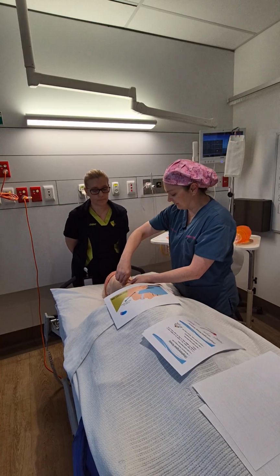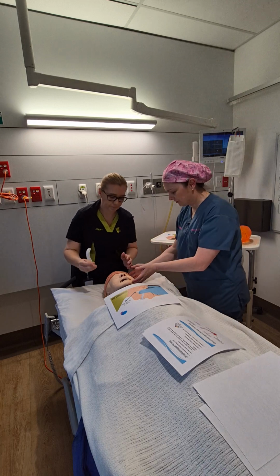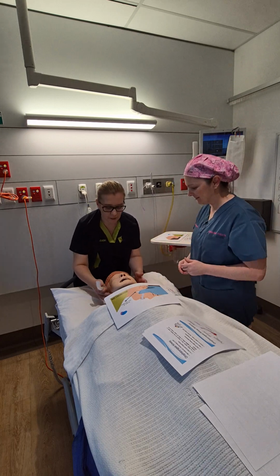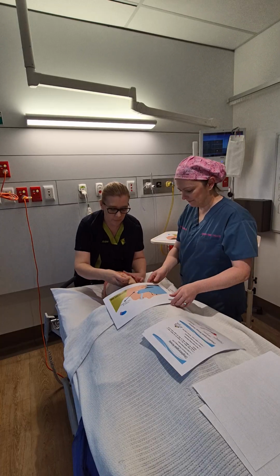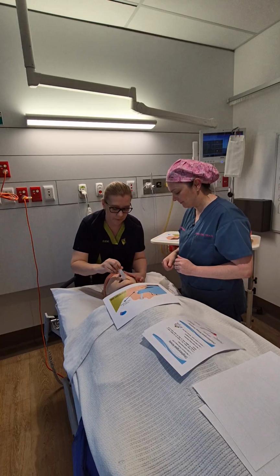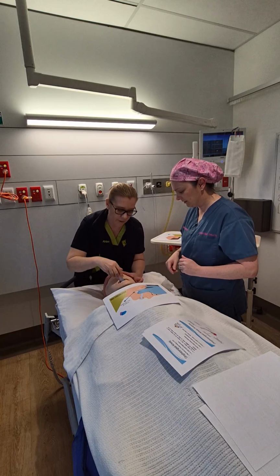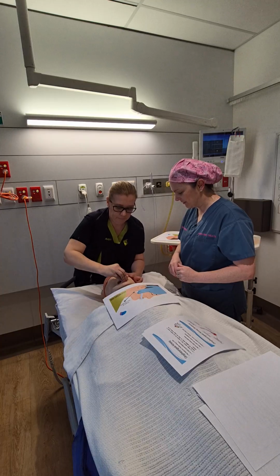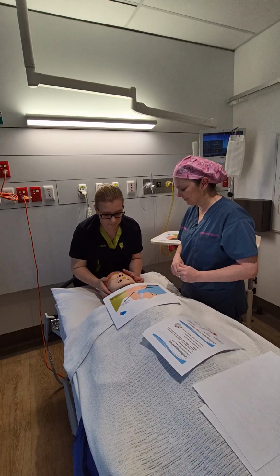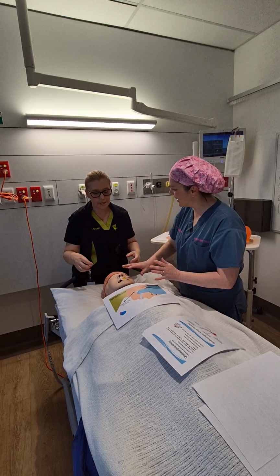Okay. Ready? You want to give it a go? Sure. Yeah. Are you happy there, or you want to go for the side? I'll probably go this side. Yeah. So then I'm going in this way. Yep, so pop around the other way. Wonderful. And then when you feel the back of the palate, push the tongue down and twist. Yeah. Wonderful. And stick it in, stick it in, stick it in. Beautiful. How easy was that? Yeah, it's actually easy. Do you want to do it again, or are you happy with that? I can do it again. Yes, please.